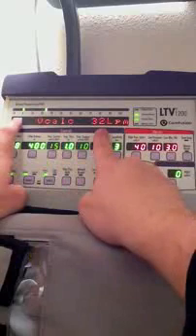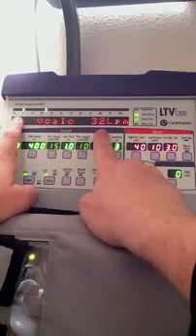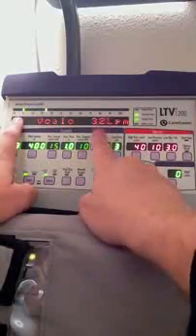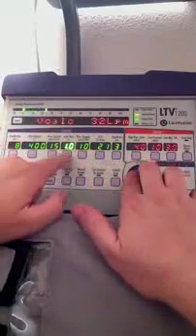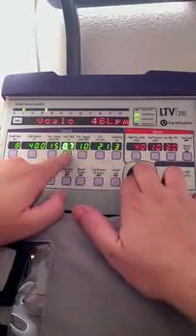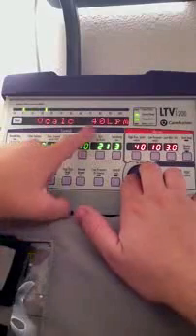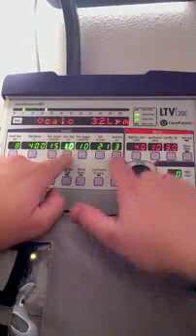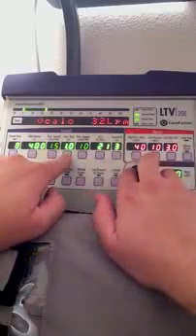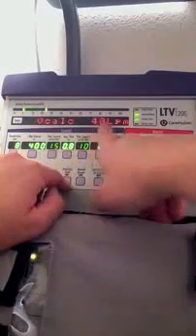Now, on this ventilator, we don't directly set our flow like the CrossVent 4, where you use your flow to manipulate your I:E ratio. On this ventilator, we use the inspiratory time. So I'm going to decrease the I time, and that should increase the flow. I decrease the I time to 0.8 seconds, and you can see I now have a flow of 40 liters. If I increase the I time back up to 1 second, my flow goes back down to 32. So I'll select the I time and put it at 0.8 seconds, which gives me a flow of 40 liters per minute.